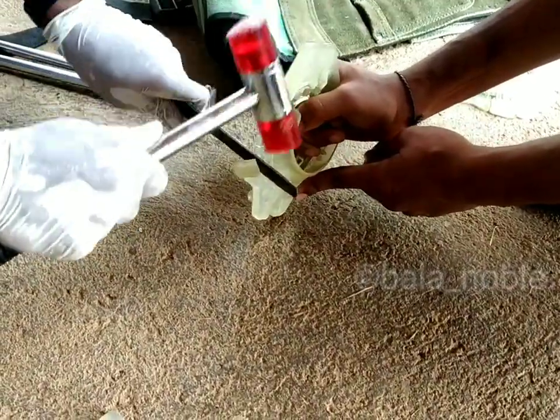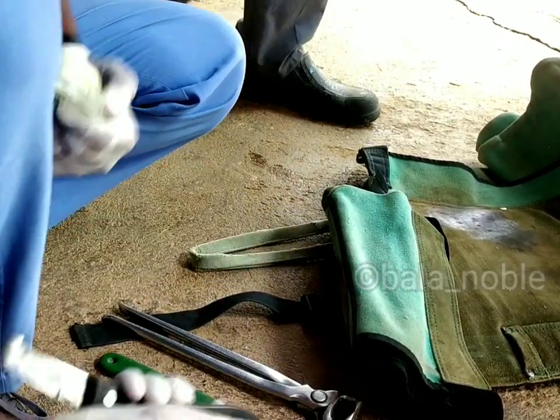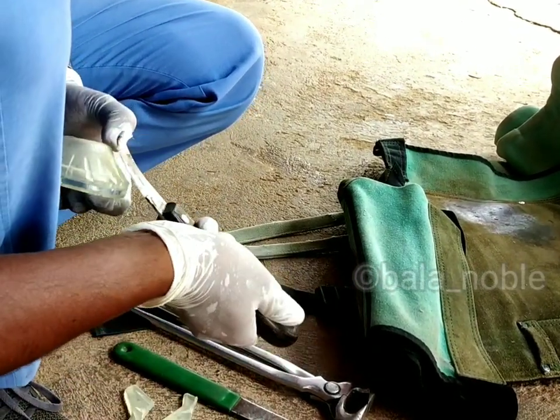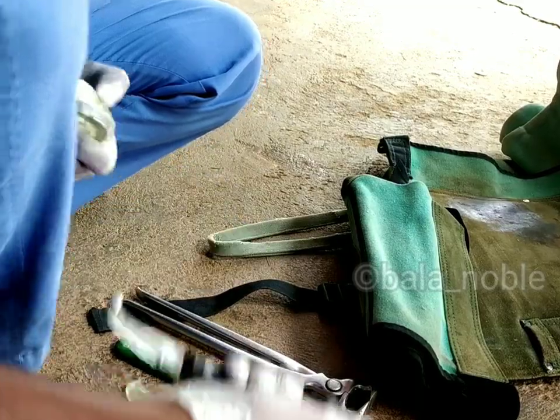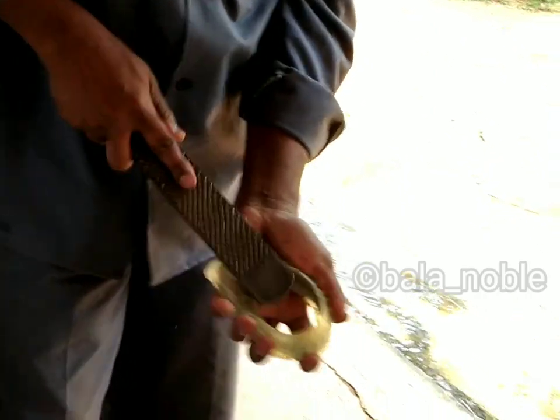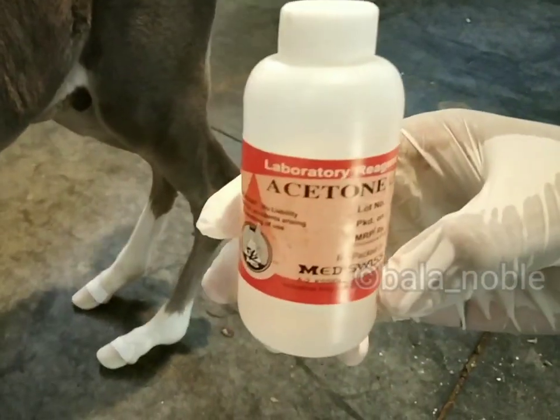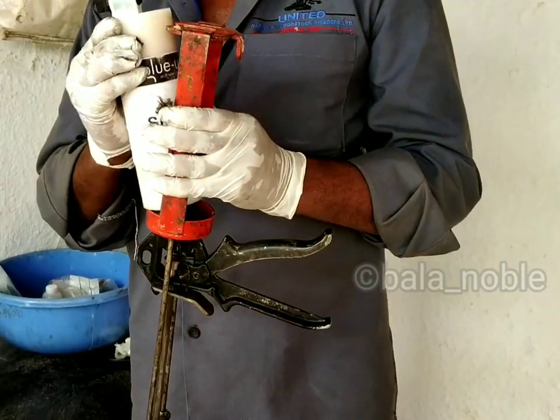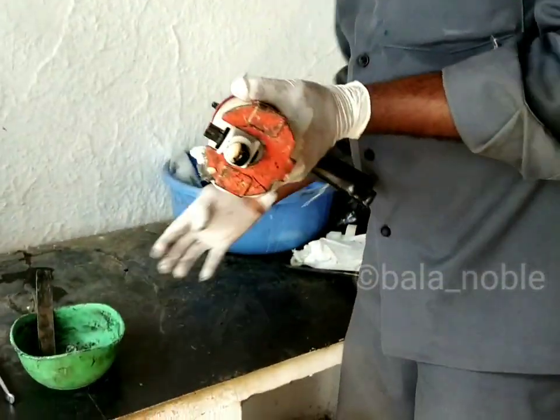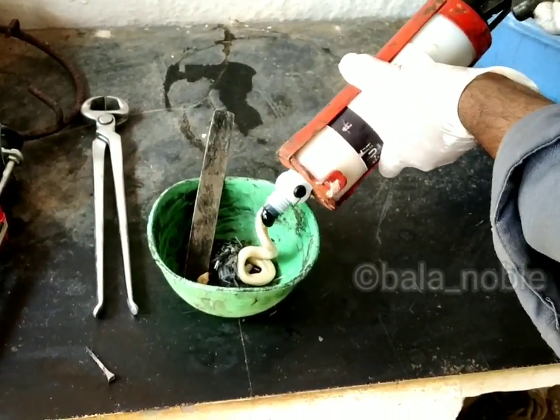Then further, we are going to clean and scale. First clean the top line with the box. The hooves are cleaned properly — you can see it — and lastly you can use acetone to clean efficiently. This is the glue we are going to use now. This glue is mixed with fiberglass material, so it will get more strength.